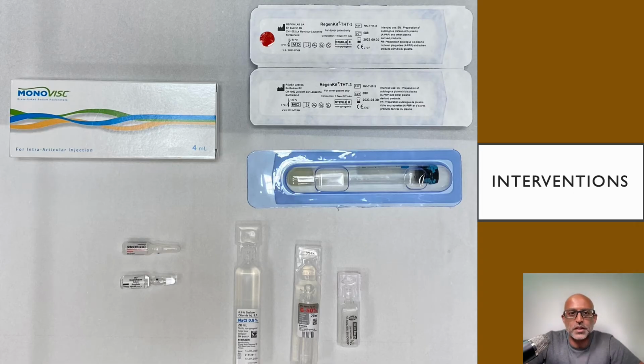So here's some of the interventions that I undertake in clinical practice. I've laid out the equipment and some of the medications just to show you the range of things. And now let's have a look at it in a little bit more detail.